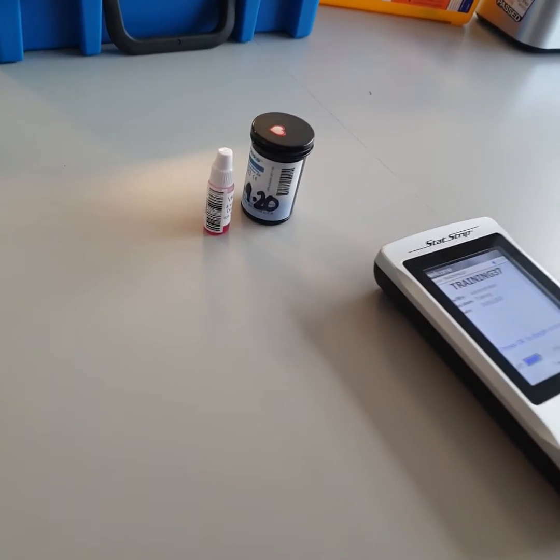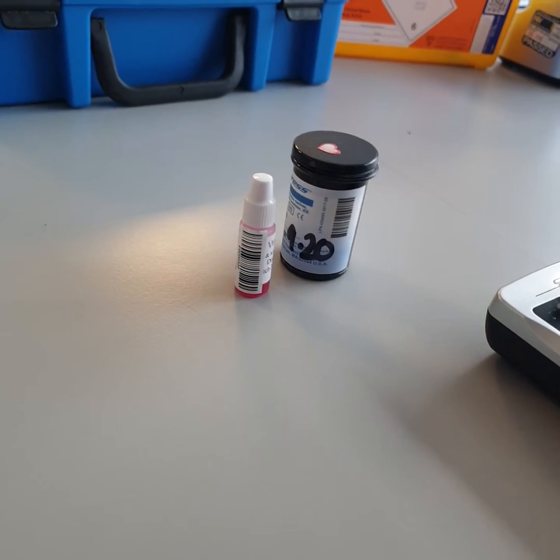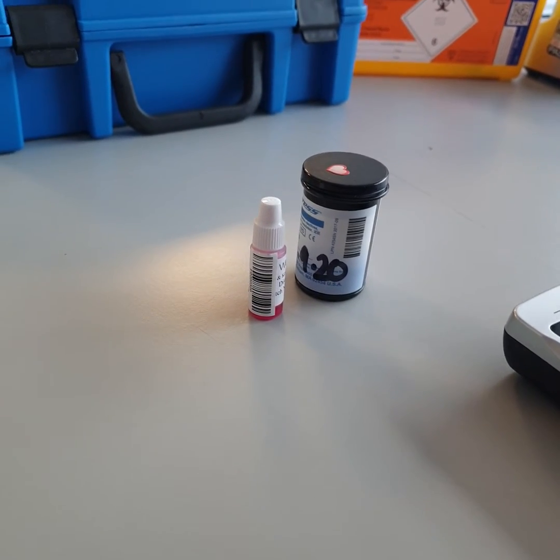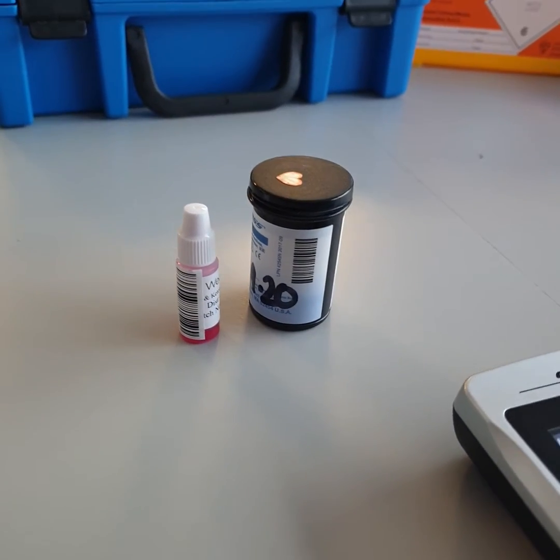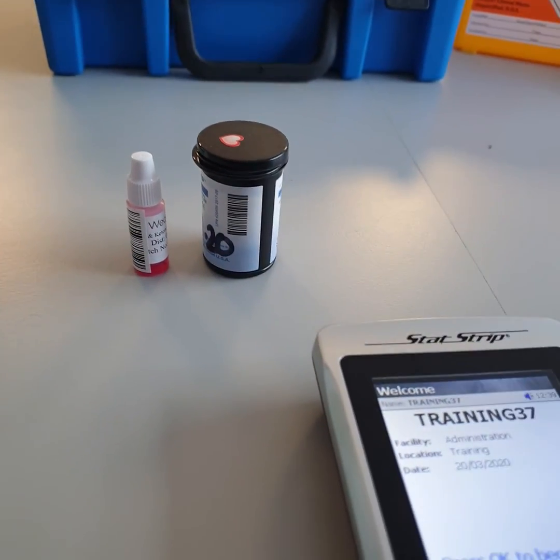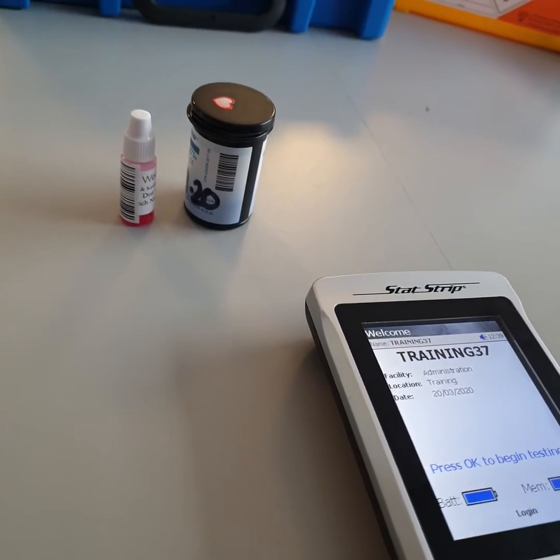Processing a glucose EQA sample to keep your barcode active. An external quality control sample is sent out to all areas that have glucose trained staff. It's to check that the meter is producing reliable results and that you have the right testing technique.